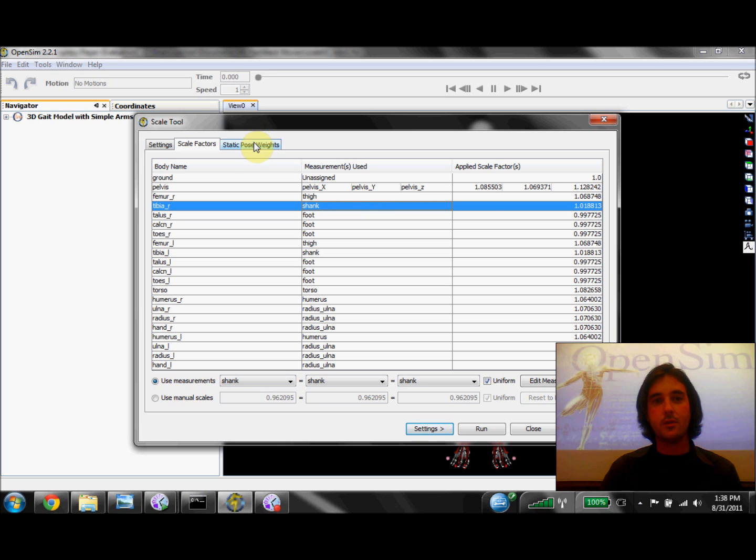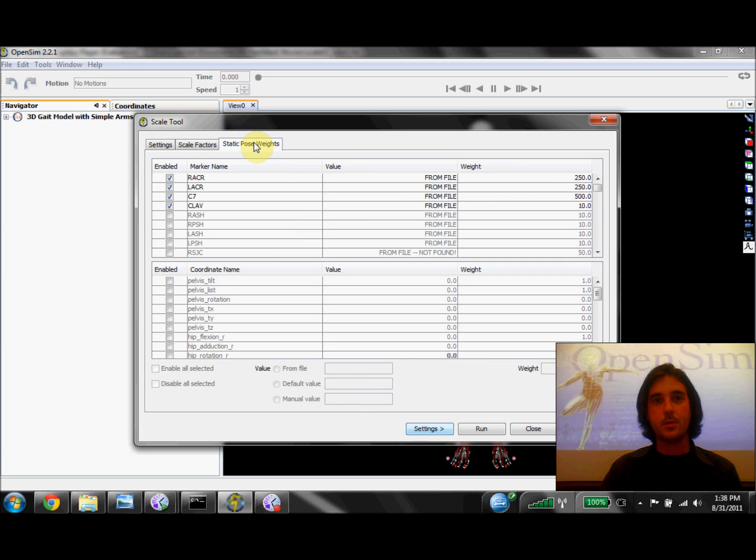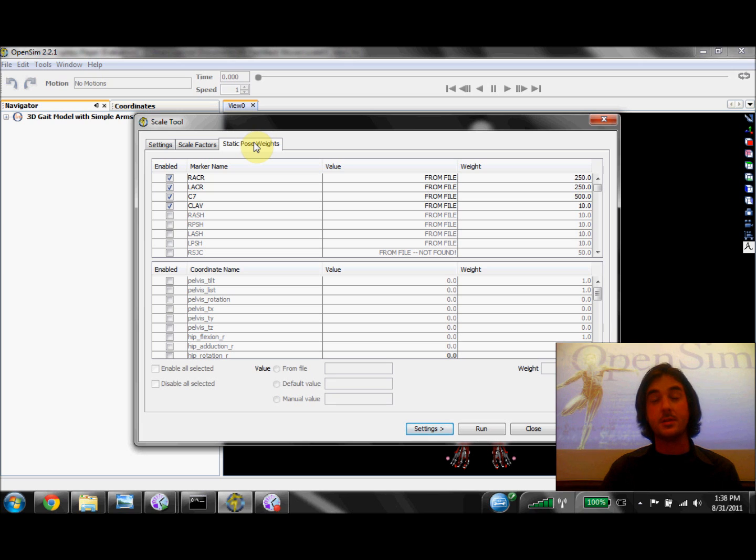Now if we click over onto the Static Pose Weights tab, we'll see a list of markers that will be used to put our model in the same pose that we recorded our subject in during the static trial.